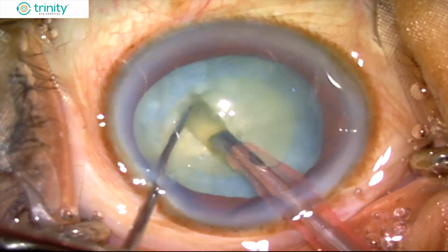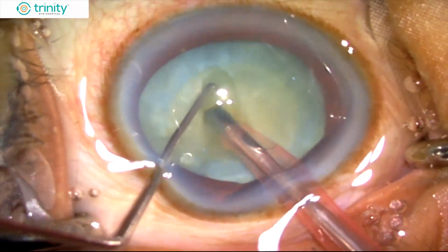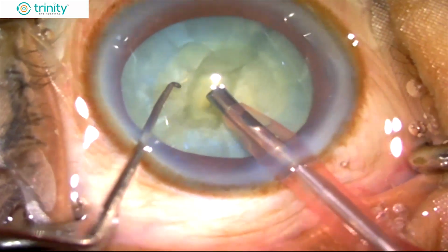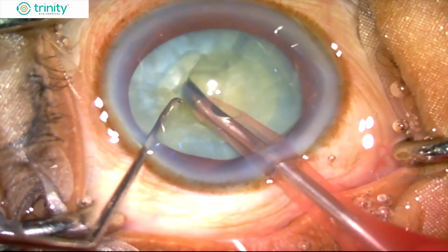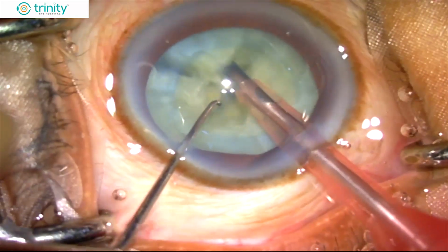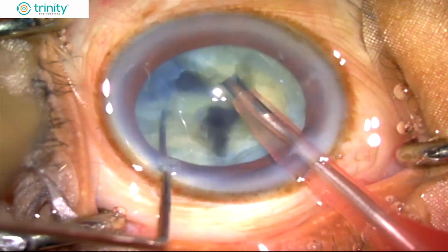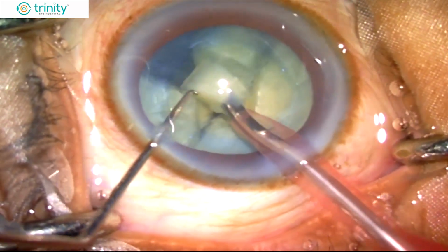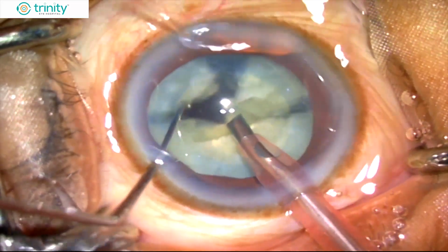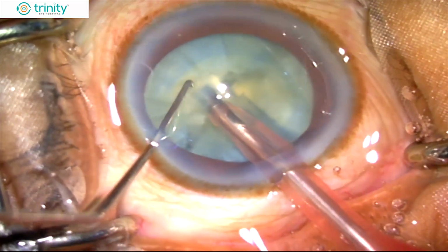Once the trench is of adequate depth, break the cataract into two halves. Rotate it again. Make sure the separation is completed and you should see a clear space in between the two halves. Now you can start breaking it into smaller pieces and make sure always that the separation is completed to the center. It's preferable to take a small piece out so that you get enough room for mobilization of the rest of the nuclear fragments. Now turn the other half into alignment, and again that also is broken up into smaller pieces.